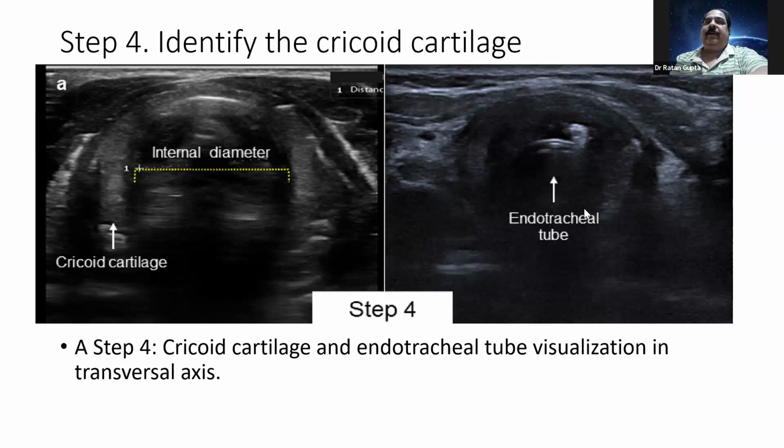I think there is nothing much to choose regarding the tube size in adult patients. In pediatric patients, you'll have to be very careful. Adult male, generally we use 8, 8.5, and female we generally take 7, 7.5. Generally that is sufficient, but I think this guidance should help.